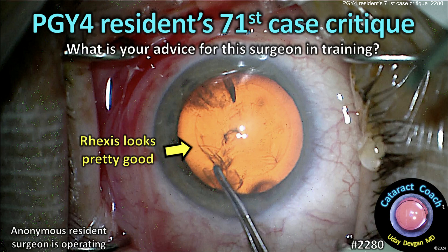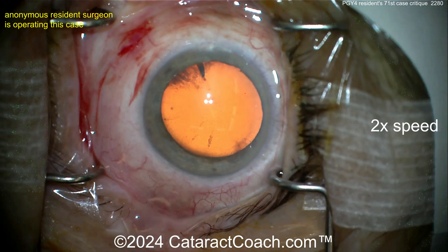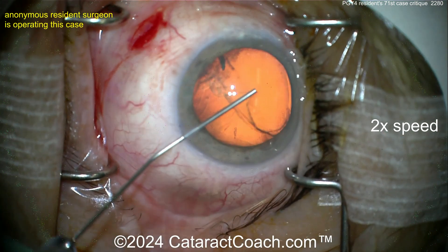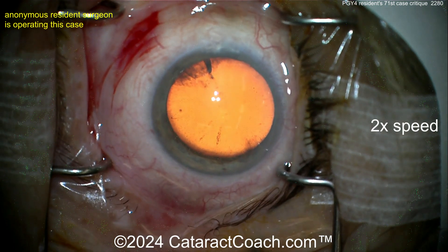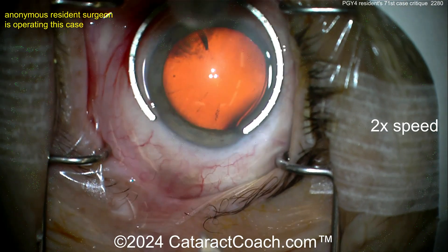Cataractcoach.com PGY4 residents — 71st cataract case critique. First things first: you're a resident, good draping, all the eyelashes out of the way, lid margin sequestered, eye in primary, good red reflex — fair enough. There's the paracentesis, full fill of viscoelastic looks pretty good, and here comes the fixation ring.